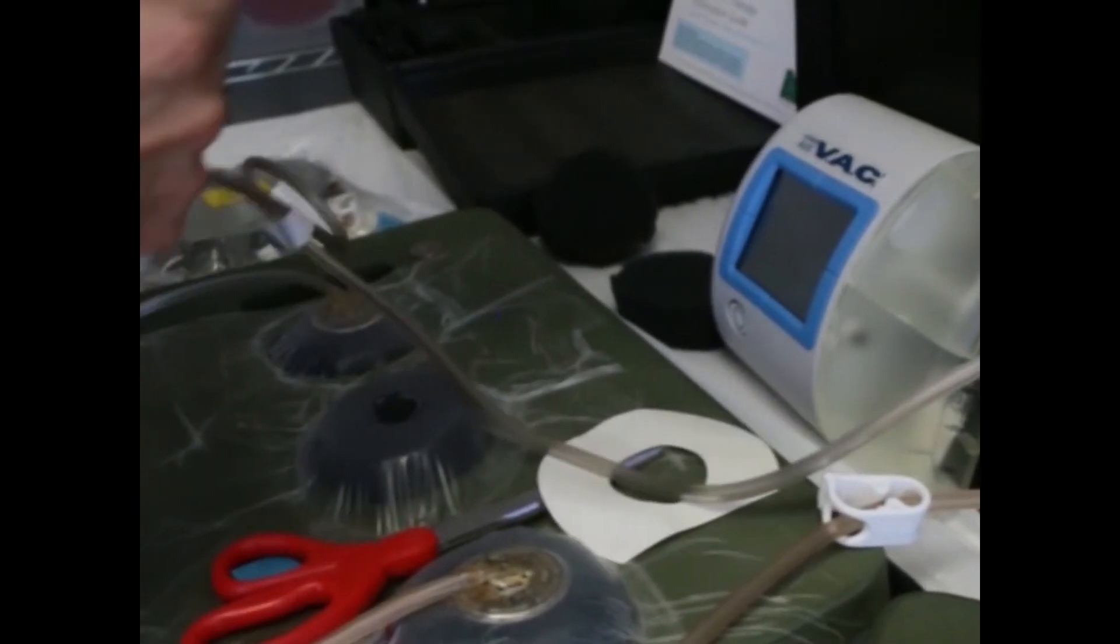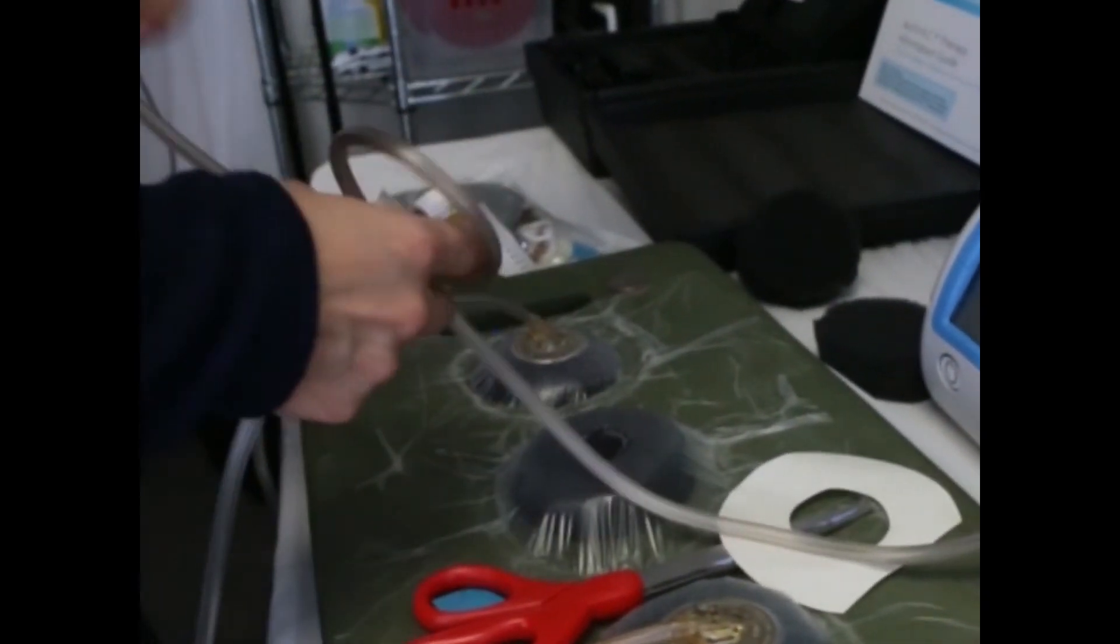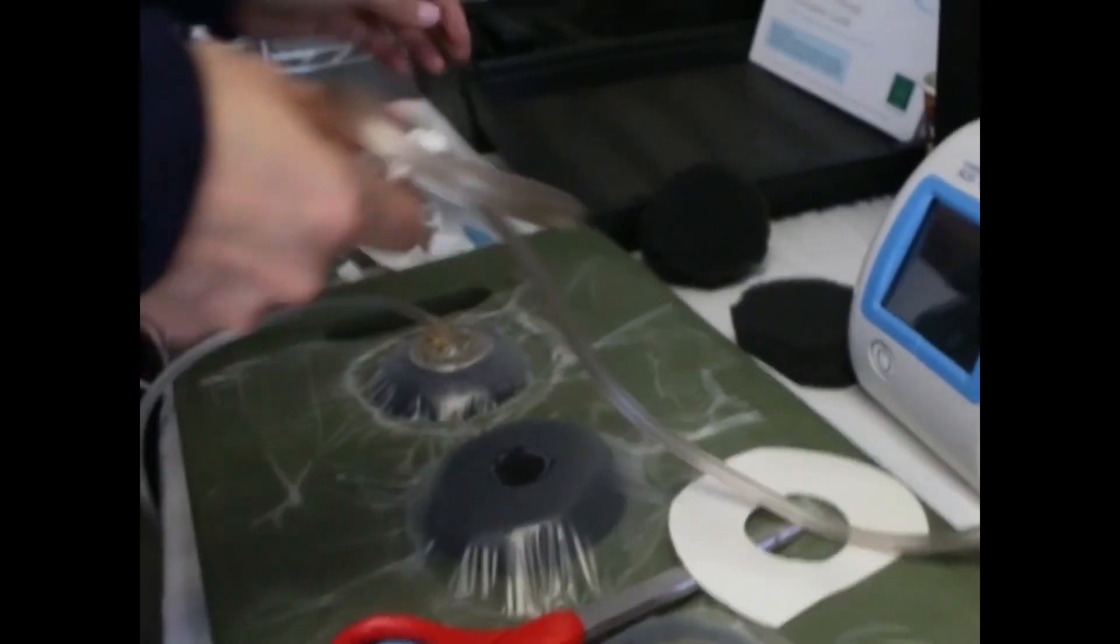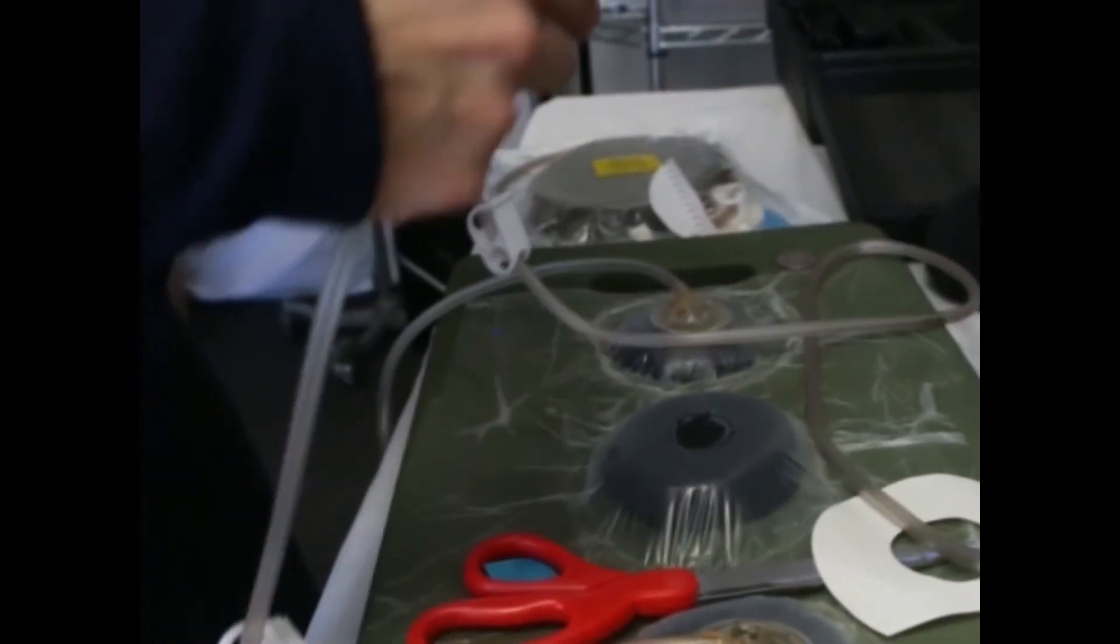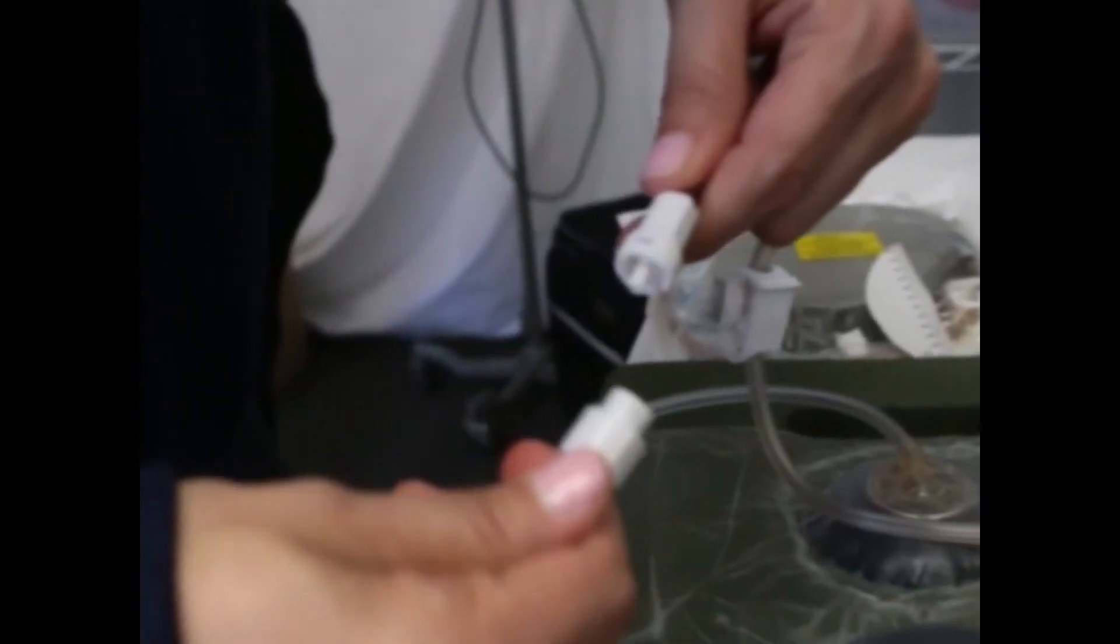To prime it, like the rest of you have to flush it? No. No. You don't have to flush it. Okay. So you just go here, and you kind of put the two little prongs inside. Yeah. And you twist this way. Wonderful. So we know that it's on. And then we just turn on the machine. We turn it on.